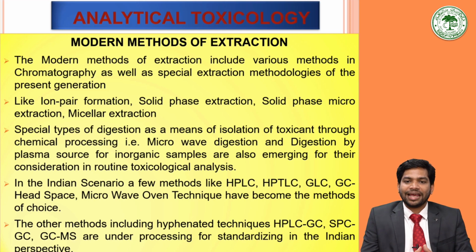A few methods like HPLC, HPTLC, GLC, GC headspace, microwave oven technique have become methods of choice. The other methods including hyphenated techniques like HPLC-GC, SPC-GC, GC-MS are under processing for standardization in Indian perspective. We will be learning details of some of the modern extraction methodologies in the next class, along with the details of the modern analytical instruments and the analytical procedures.